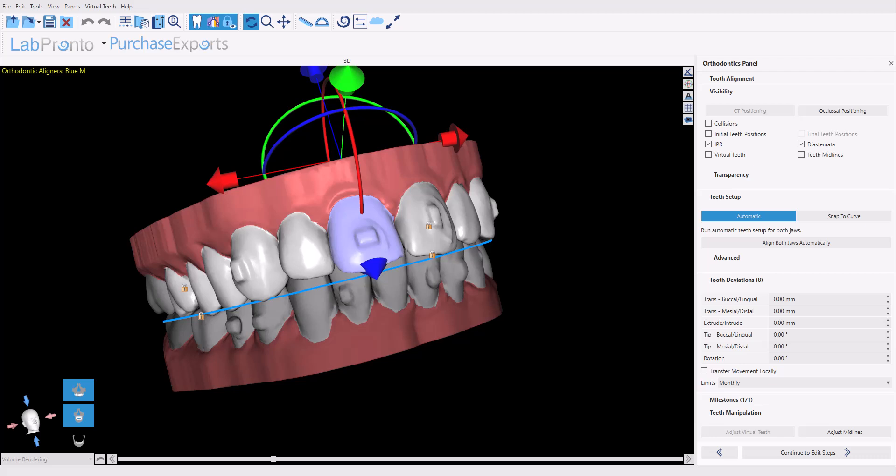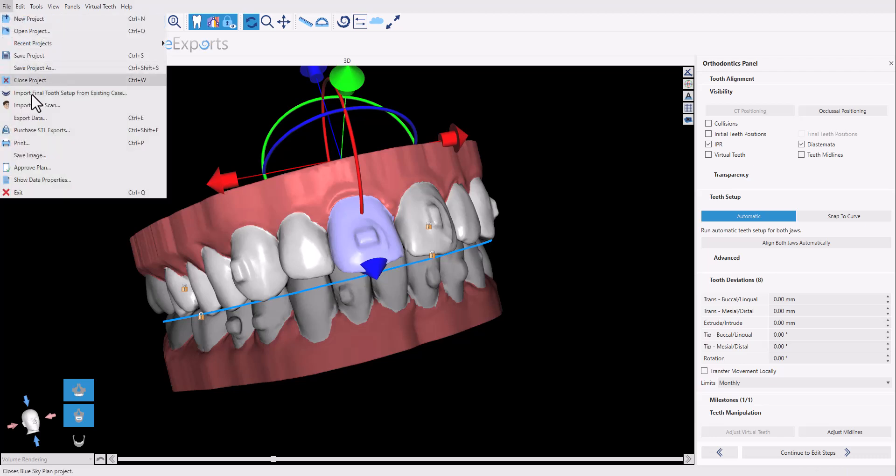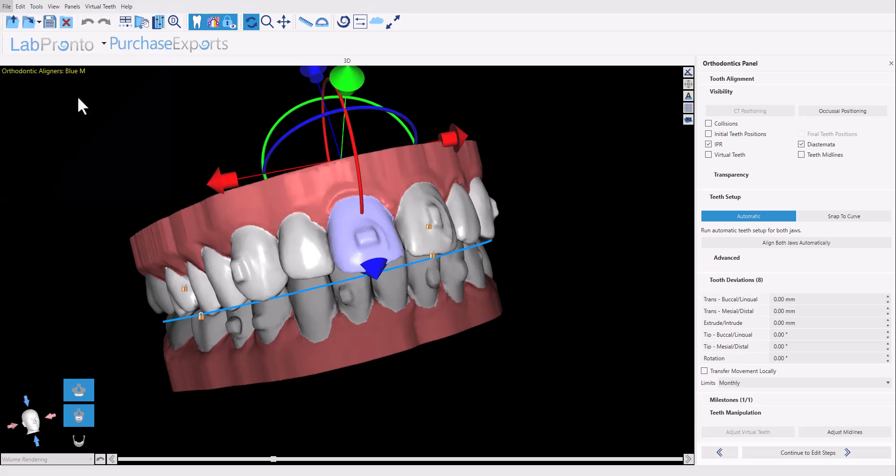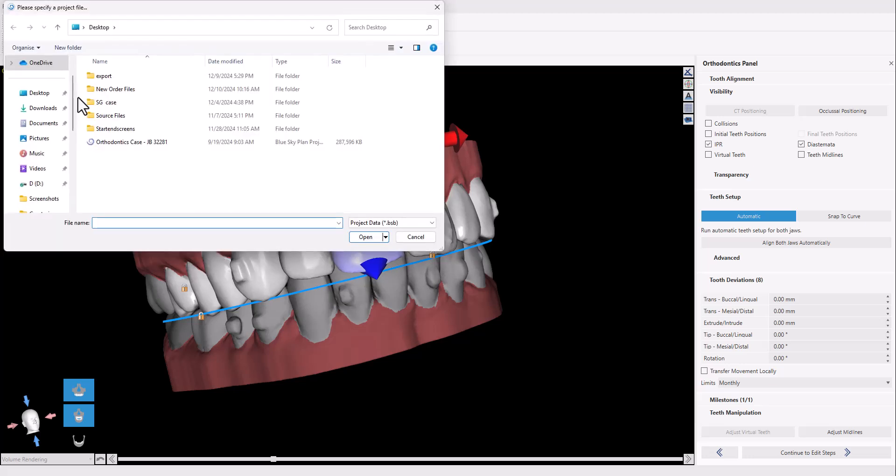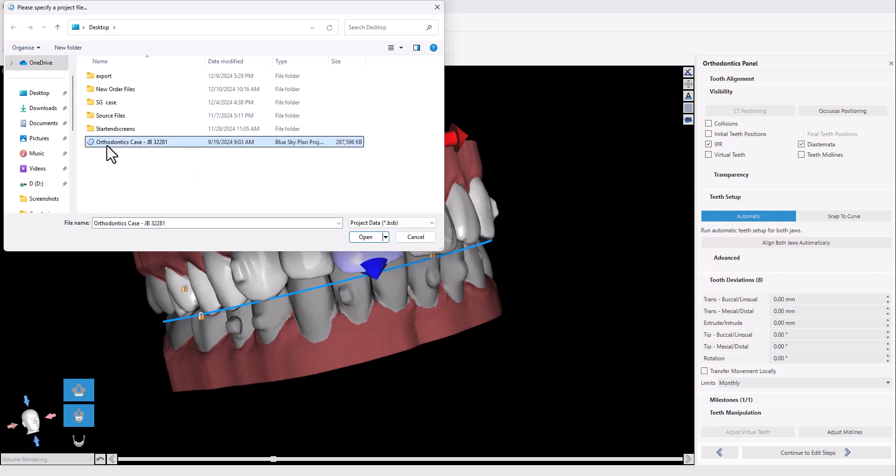So what we're going to do now is we're going to go to file, import final tooth setup from existing case, because that's exactly what we want to be doing. We're identifying the original plan that was already planned for the patient, and we're going to click open.